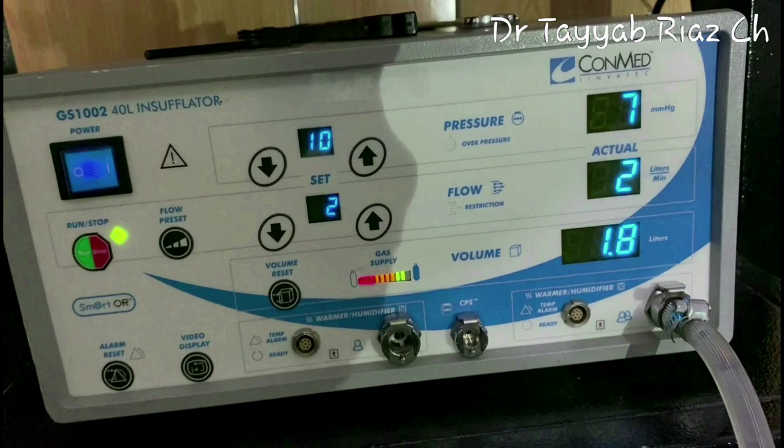And I have set the preset flow rate at 2 liters per minute. It varies from age to age, and there is a formula that is 0.1 liter per minute per year. So at 10 years, it is around 1 liter per minute, and it should not be more than 2.5 liters per minute on Veress needle mode, because the maximum capacity of the side eye of the Veress needle is 2.5 liters.